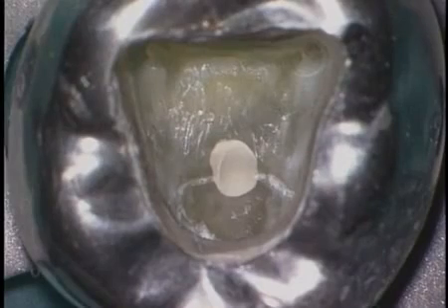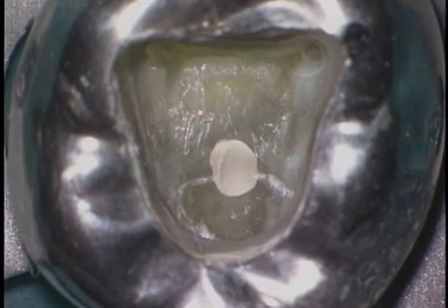condense it to place. It's fine to overpack the material and carry it out past the margins, because once the material begins to set, a spoon can curette it back and give you sharp margins, and the perforation defect can be dressed out and managed.